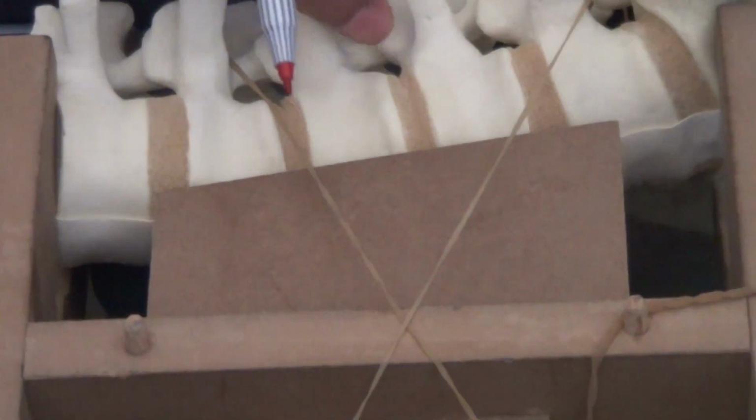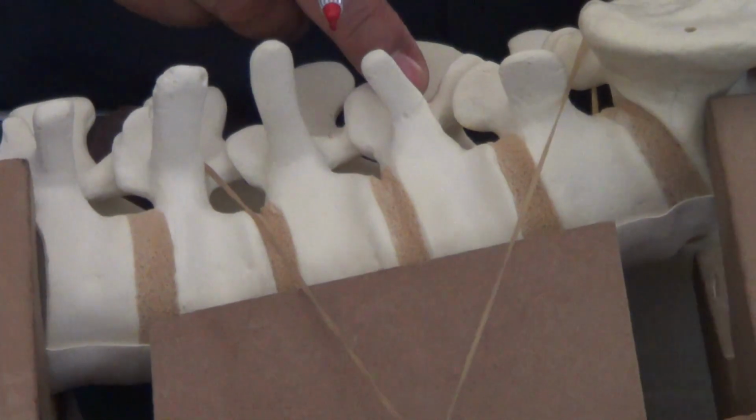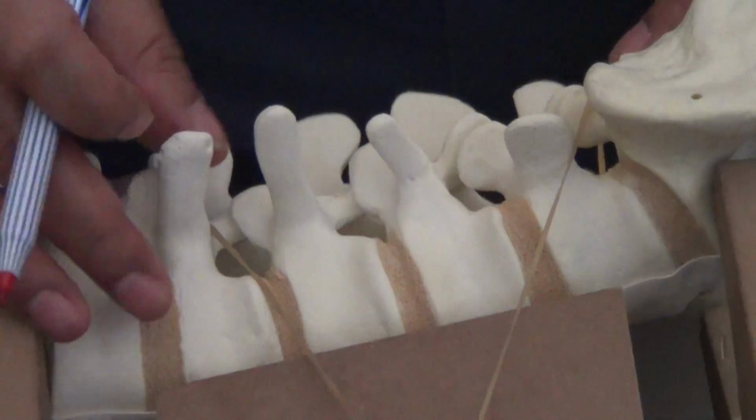If you can turn around here and you look where the pedicle is, this happens to be right at the center of the entry of the pedicle there. So that's what the entry point is, right?